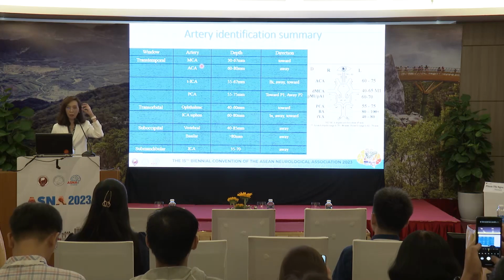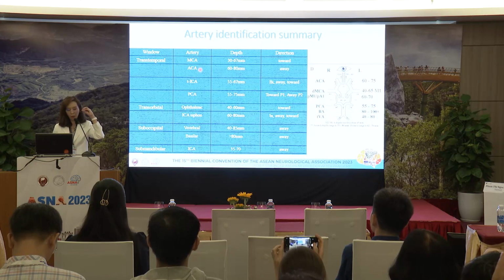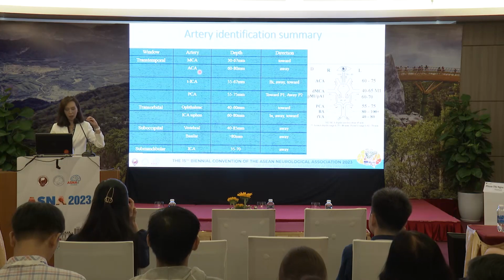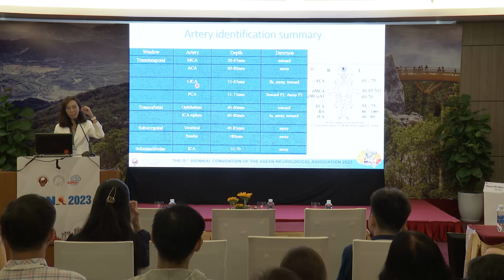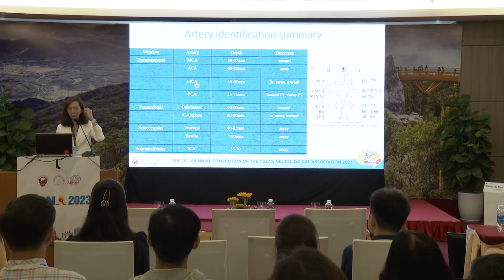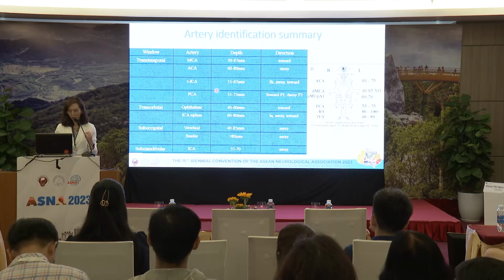And then we move the probe to the anterior part a little bit to find the ACA. But the anterior cerebral artery is going away from the probe. And then we move the probe a little bit downward to find the ICA, and then a little bit backward. This is just minor movement of the probe. We'll try it in the hands-on session to the back, and we'll find the PCA. So that's for the transtemporal.